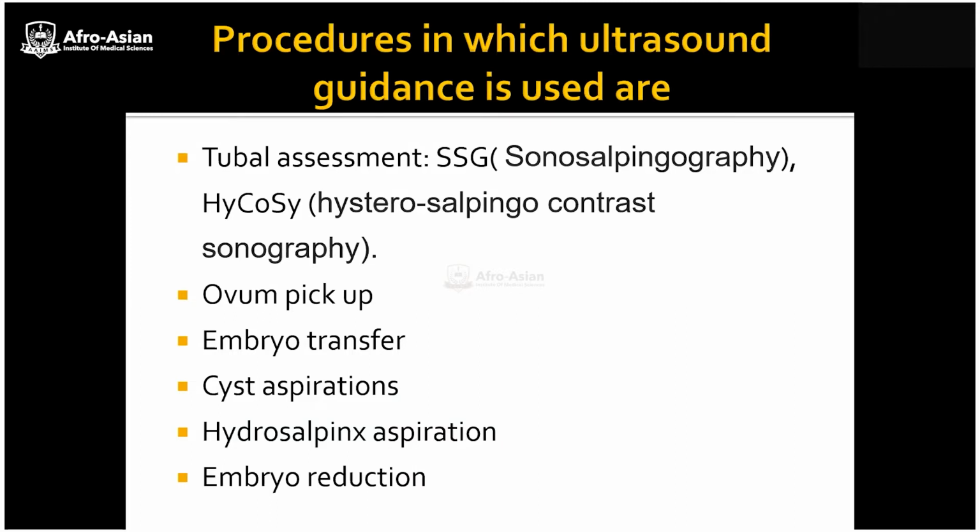The first one is sonosalpingography, which is also abbreviated as SSG. As the name shows, it is the sonography of tubes.